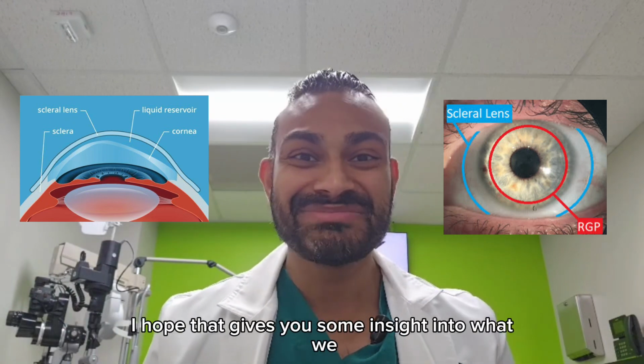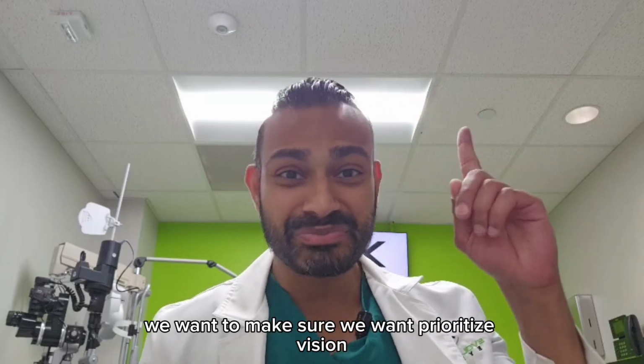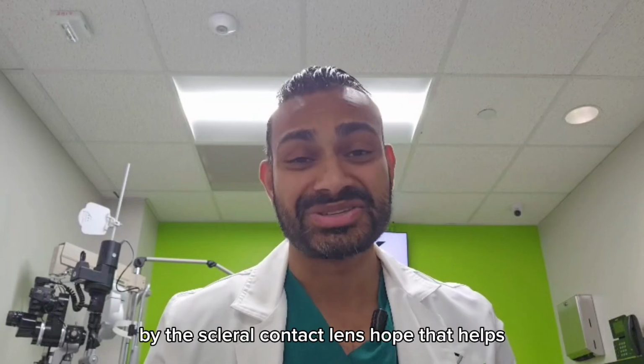So I hope that gives you some insight into what we as scleral lens doctors are looking at when we see our patients behind the microscope. So I want to make sure we, one, prioritize vision to make sure that we get the best visual outcome we can, but also that the ocular surface is not being impacted by the scleral contact lens.